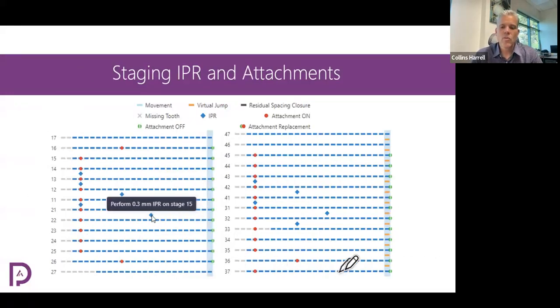We'll show you in a minute where you can find this chart right here in the Progressive Aligner Doctor Portal. And this chart, if you don't understand what you're looking at here, is basically showing, for each different tooth, so here are all the tooth numbers, the total number of aligner stages and the blue stages.